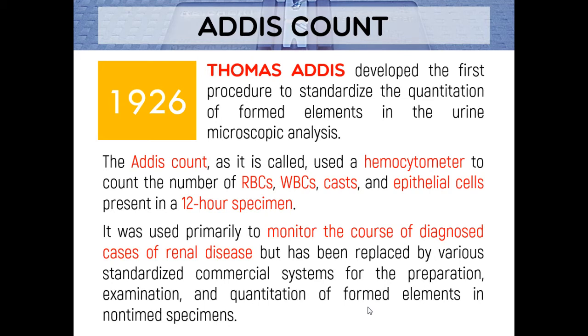It was created to monitor again the course of diagnosed cases of renal disease because again, makita naman nato, diba nakita nato sa atong microscopic exam, each of your urinary element, may it be a cell, a cast, or a crystal, etc. They have their own clinical significance, diba? So in a way sa atong pag-discount, atong pag-quantitate, makita nato if unsa na ba jud ka grabe ang kidney disease sa patient, like naayo ba siya, nagka-okay ba iyang prognosis meaning nagka-okay ba iyang condition, maayo na ba siya inana or nagka-worsen. Okay, so muna siya point ana.